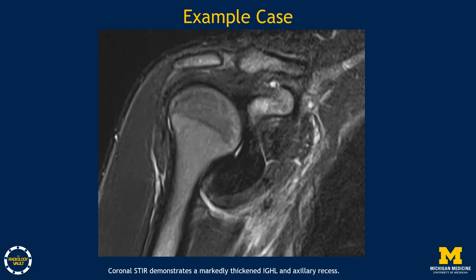Here is an example case of marked thickening of the inferior glenohumeral ligament and axillary recess. This particular case is significantly profound, and in most cases you will not see the IGHL be this thickened. It is important to note that you don't need to have the constellation of thickening, edema, and indistinctness — any one of these signs can be present with adhesive capsulitis. The signal and morphologic changes in the inferior glenohumeral ligament and axillary recess has been shown to be the most specific sign for adhesive capsulitis on MRI.